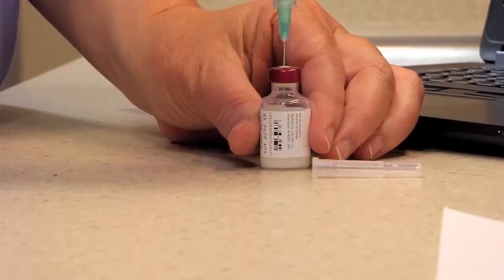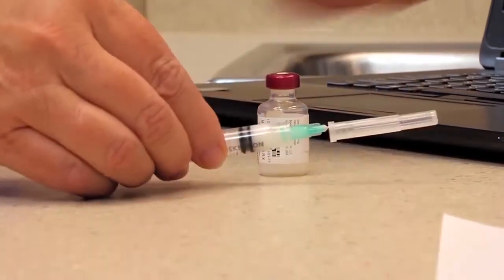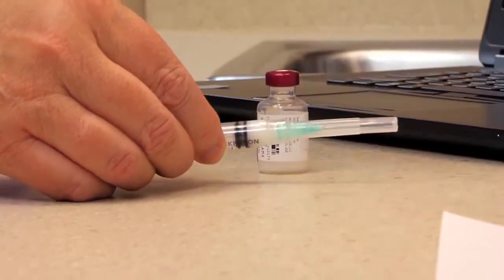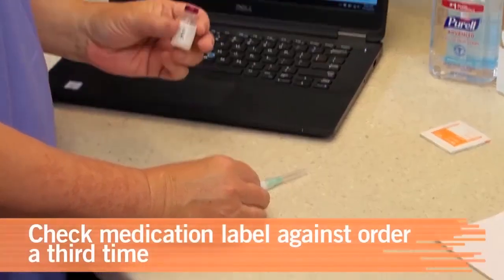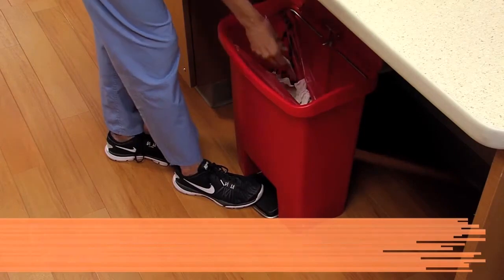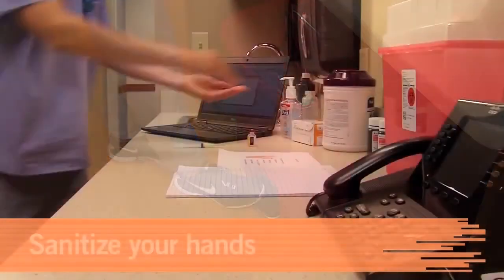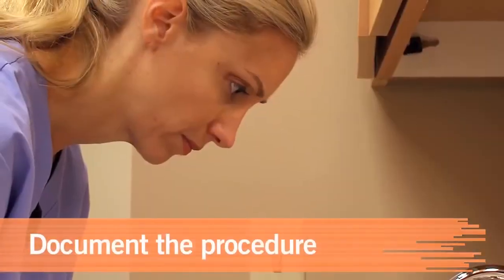Using the right technique, withdraw the needle and replace the needle cover. Be careful not to let the needle touch anything, including the outside of the cover. Confirm the order against the vial label one more time, your 3rd label check. Then return the medication to storage. Finally, dispose of any used supplies like the alcohol wipes. Sanitize your hands. Record the right documentation.